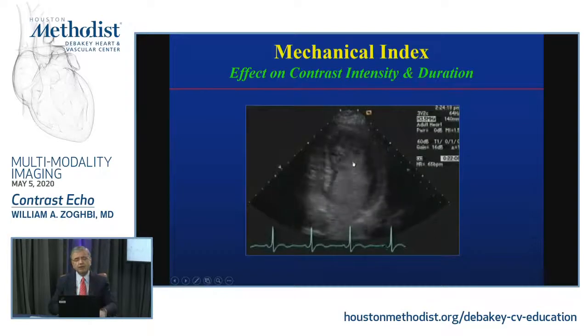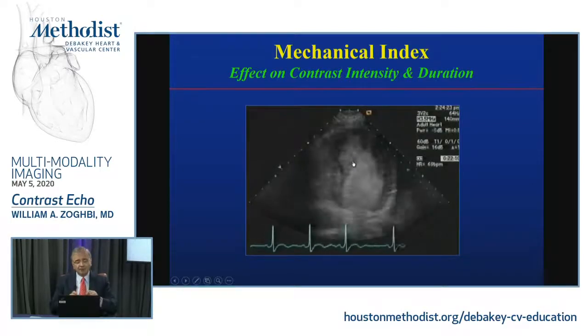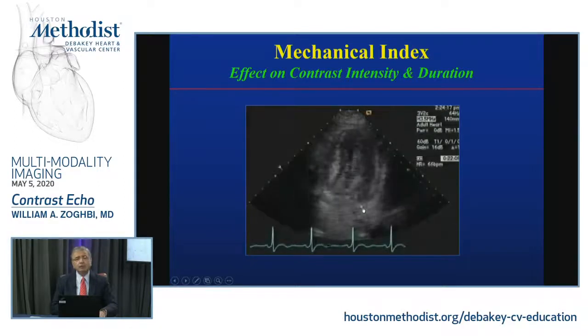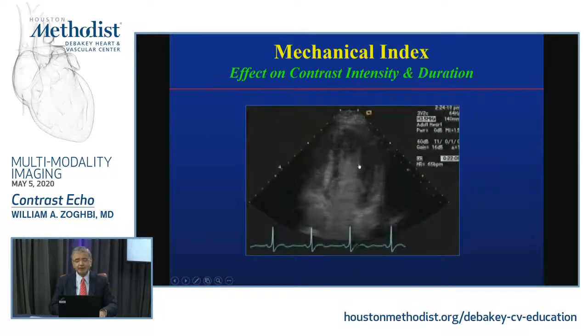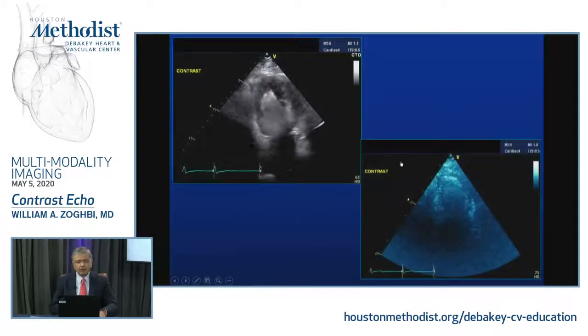You're not filling the whole ventricle. So therefore, it's not that you don't have enough contrast. You're just destroying it. And the way you know you have enough contrast is by looking down at the left atrium. The left atrium is really full, right? So that's what tells you that you're destroying much more. It's not a contrast problem, if you will. You have enough contrast, but you're destroying it much more.